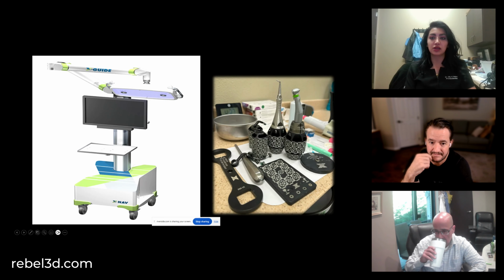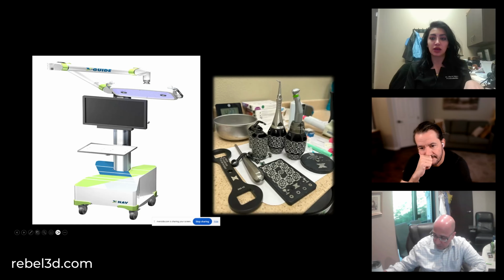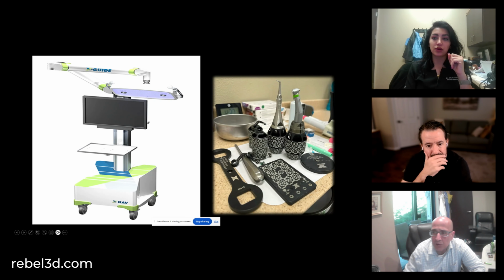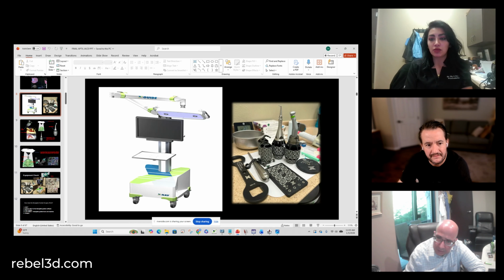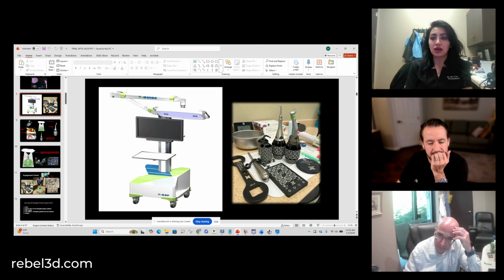Yes. So I'm just going to explain the basic armamentarium that comes with the machine. This is the machine itself. You have the handpiece that comes with the tracker attached to it. Basic armamentarium, you need your wrenches and tools to make sure everything is nice and tight, nothing coming loose during surgery. You have your calibration plate, your calibration armamentarium here, to help you make sure that this tracker and the handpiece are all aligned to your cameras.